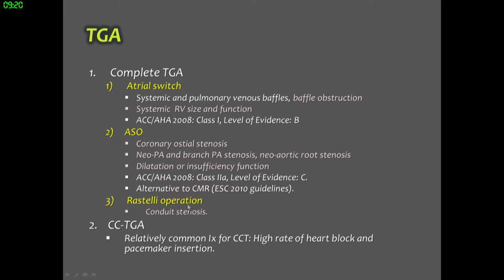After Rastelli operation, evaluating conduit stenosis is important. CCTGA has a high rate of heart block and pacemaker insertion, and so is a relatively common indication for CCT.